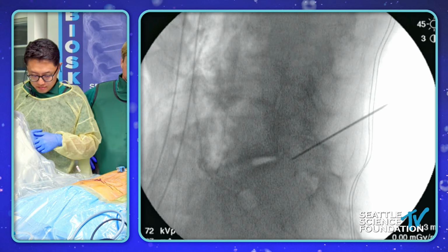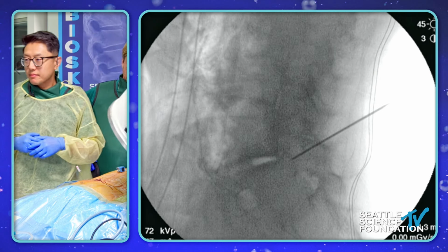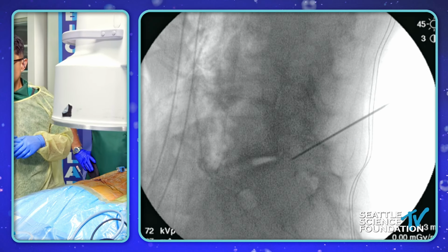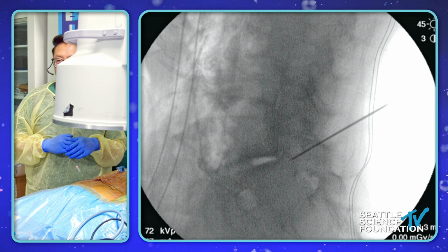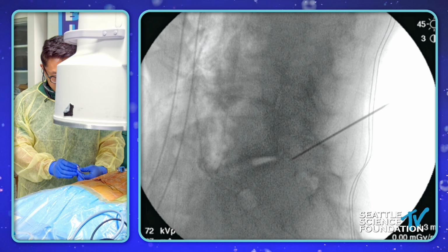And that's part of the patient discussion. That's part of everyone being in your room and having buy-in from all the folks in your operating room. You have to be able to just bite the bullet and make another incision. Yeah, absolutely. I think that's a great point. I mean, it's no big deal at all to make another incision like this.